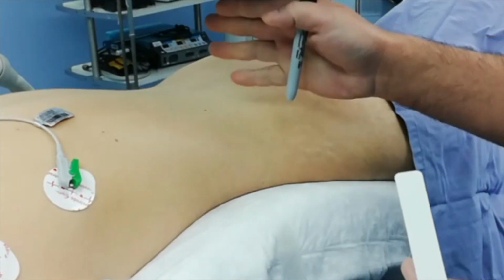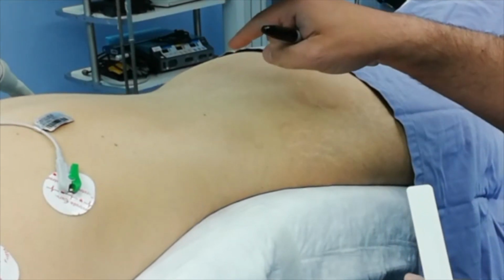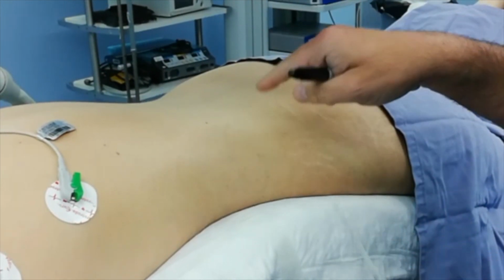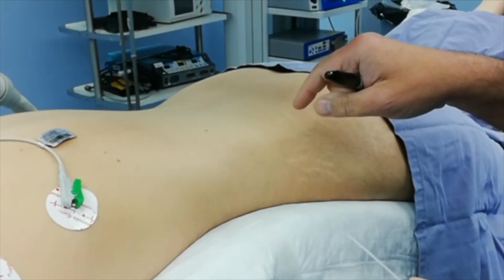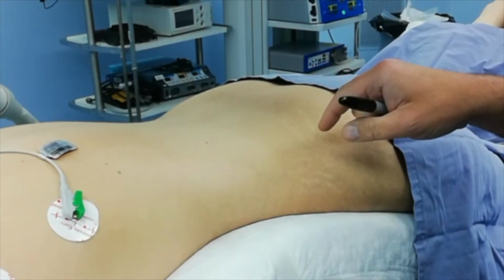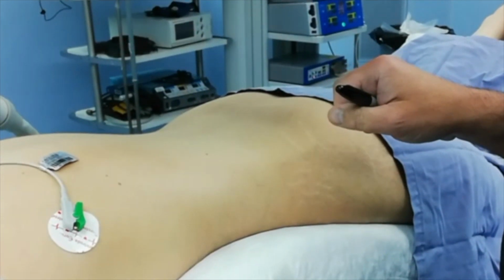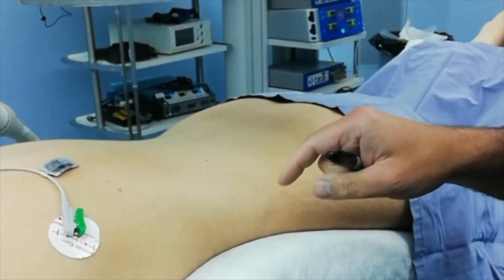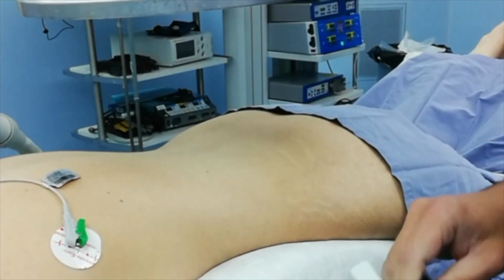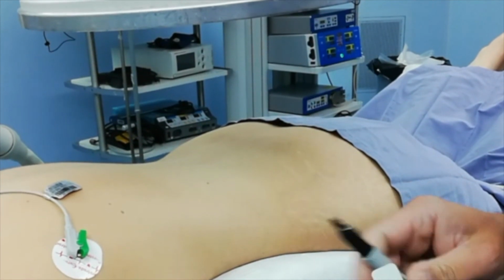So the patient is positioned in the prone position, as we can see here. So we will do L4, L5 posterolateral disc herniation on the left side, as I explained on the MRI. So the patient didn't have any muscle relaxants with induction. It is actually possible to give the patient a little bit of muscle relaxant with induction, but nothing afterwards, because you do need that feedback mechanism from the patient's leg if you happen to touch the root or come near it.